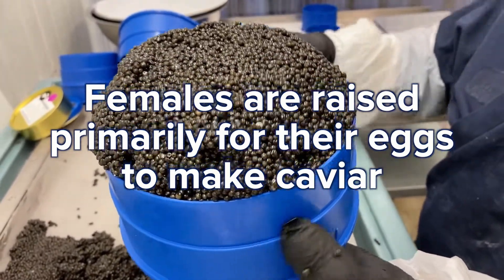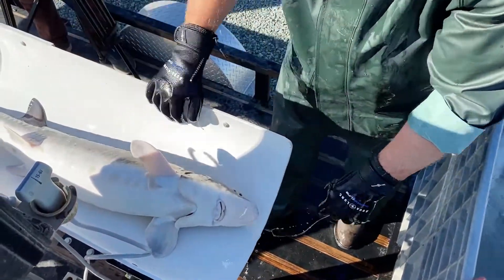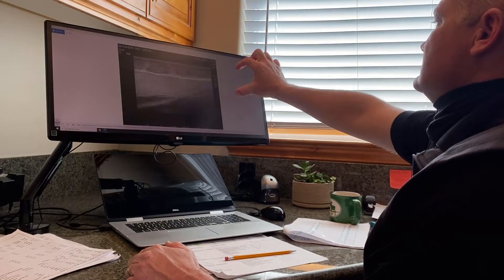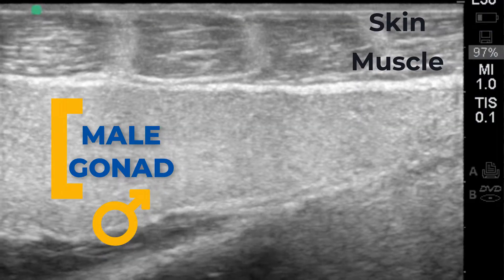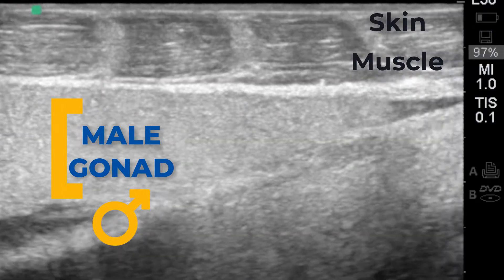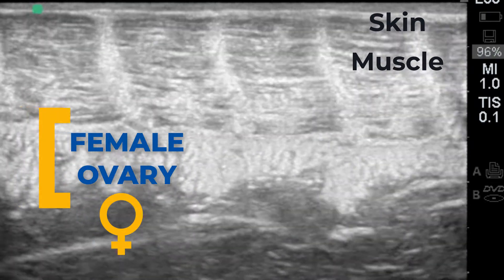Let's look at three fish. First, an immature four-year-old male and a female. Notice the solid band which differentiates the male. In the female we can see the folds of the developing ovary.